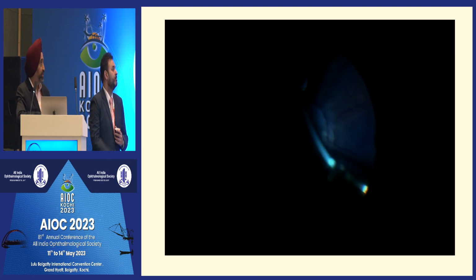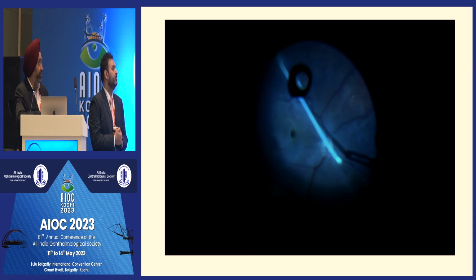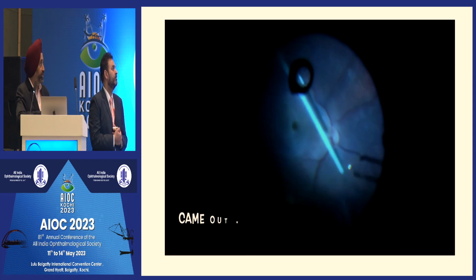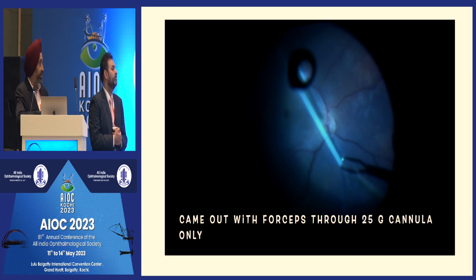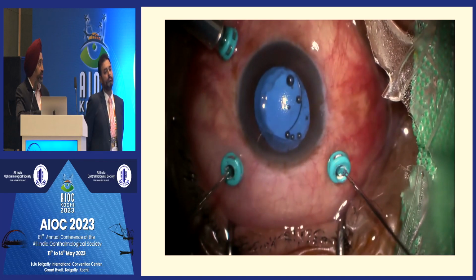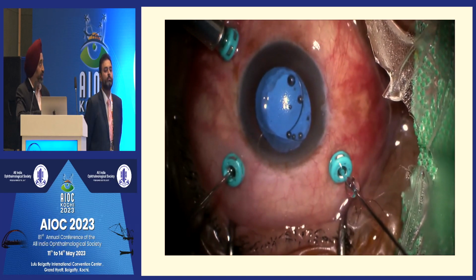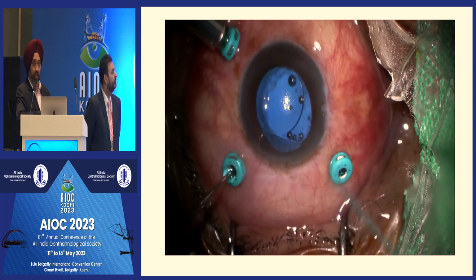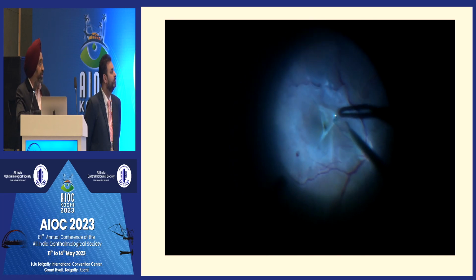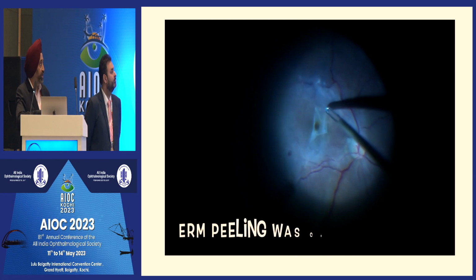So I was operating this patient. First of all, the green tip fell inside, and sometimes it happens. They go inside, but it's easy to take it out. You can take it out through the same port in the non-valved cannula. That's okay. So I was trying to complete the surgery there.